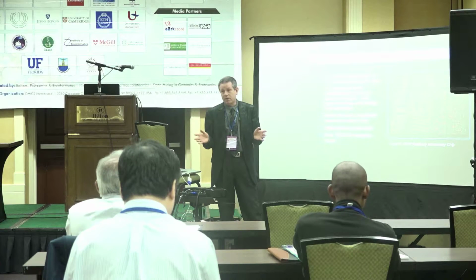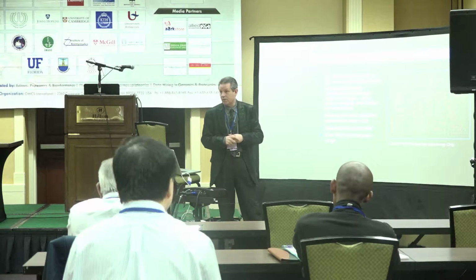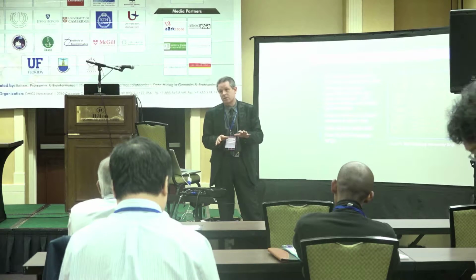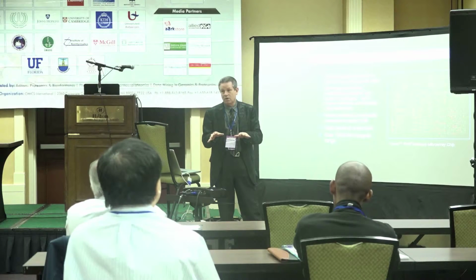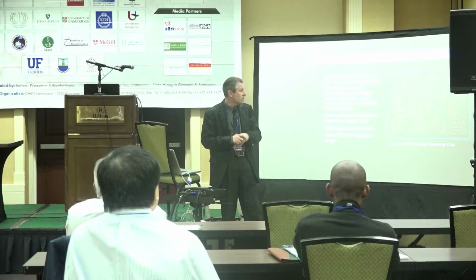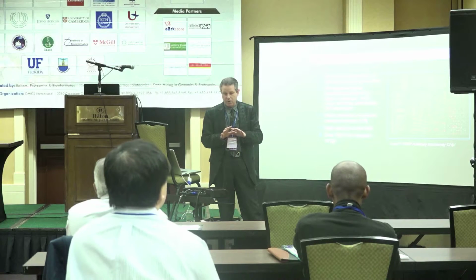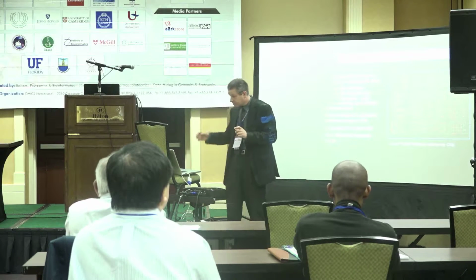All of these antibody microarrays are now off the market, with the exception of the Full Moon one and ours. And that's because the data from the microarrays is very difficult to reproduce by Western blotting. Often the antibodies aren't available to even do those experiments. It's very expensive. And it turns out that the way they were doing it was actually fraught with technical difficulties. So I'll explain that in a moment.